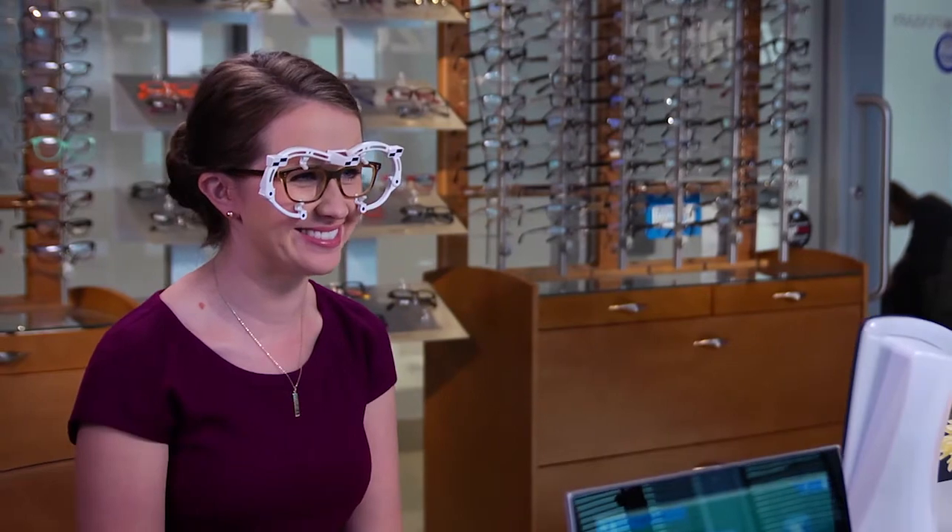Our measurement system allows us to personalize your lenses and positions the lenses precisely in the frame to within a tenth of a millimeter. If the patient is purchasing several frames, you should do a fitting for each pair after making the proper adjustments.